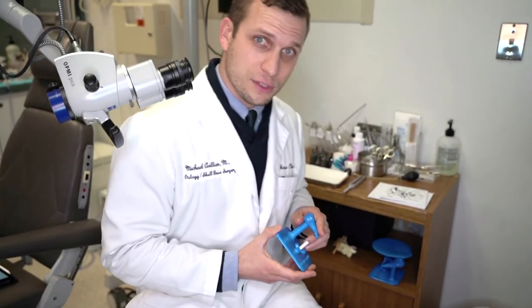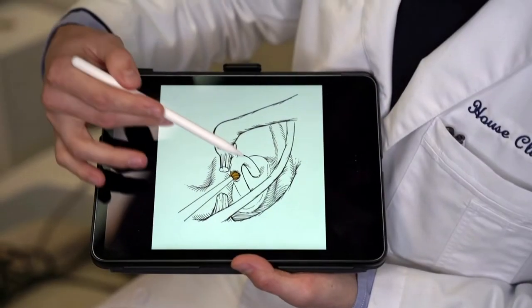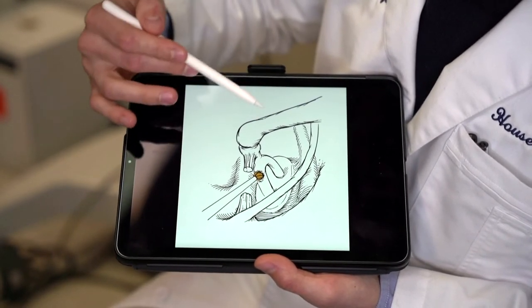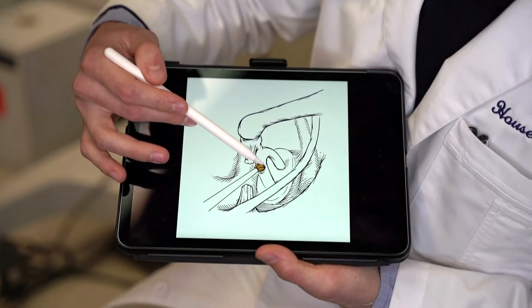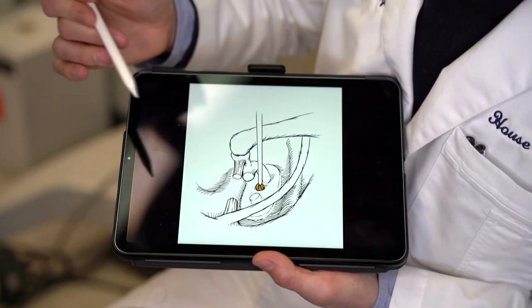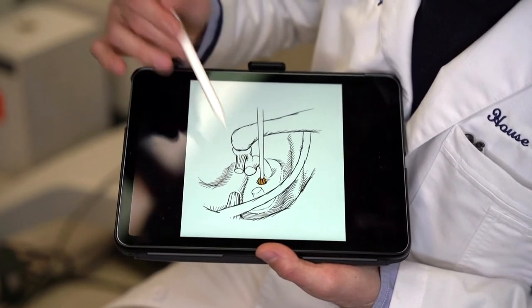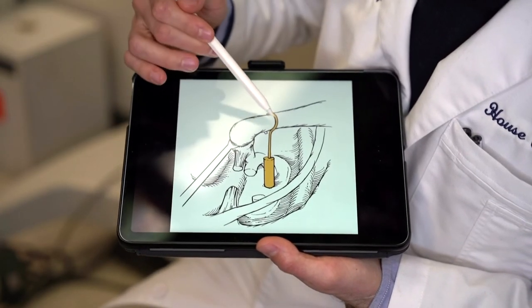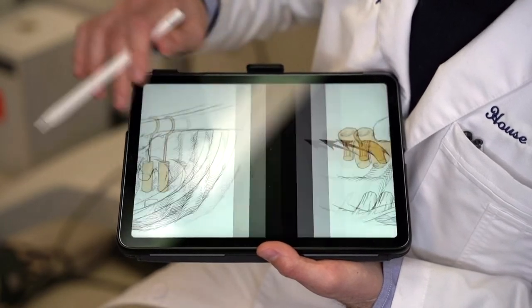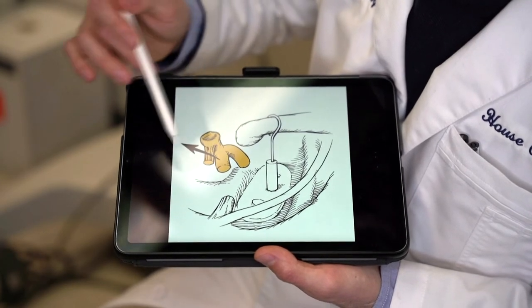I'll go over a few pictures as well to explain the procedure. Here's another photo showing the stapes and the incus. The arch of the stapes is being drilled away. The next step is to make a tiny hole in the stapes footplate. The prosthesis is then placed into that hole, and the rest of the stapes superstructure is taken away.